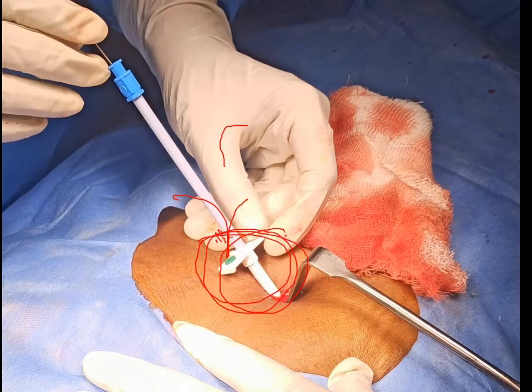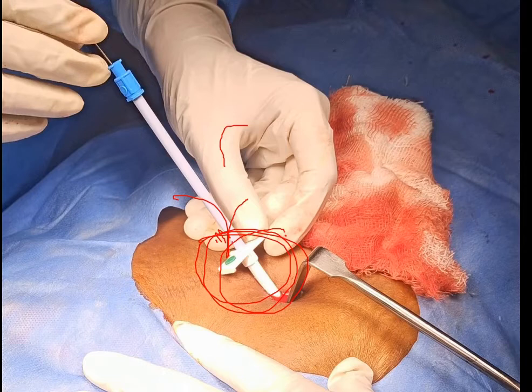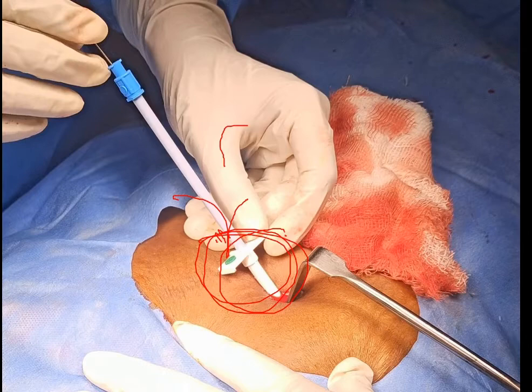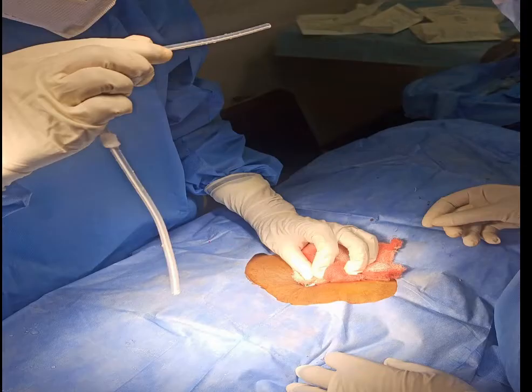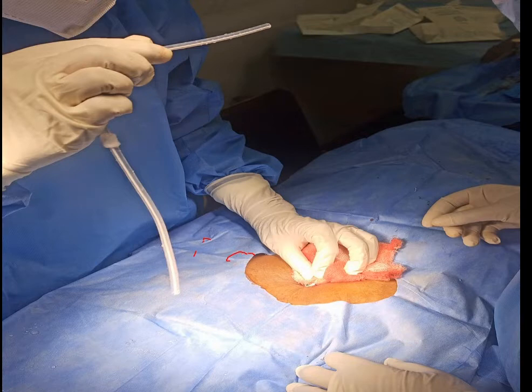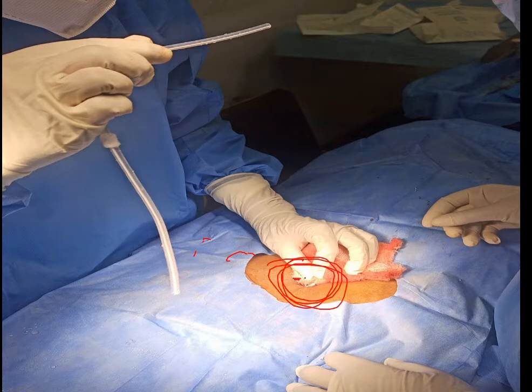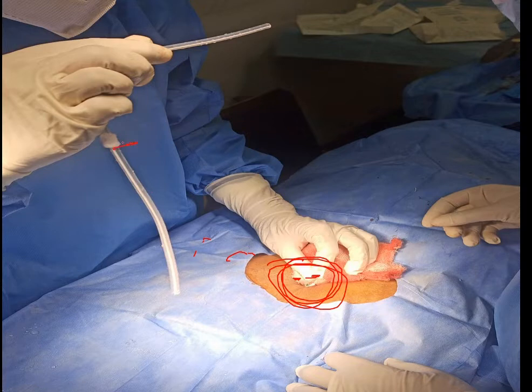Meanwhile we slowly remove the guide wire and the dilator together, similar to the permcath insertion. At this point the patient might experience significant pain. Once we have removed the dilator along with the guide wire, only the peel-off sheath remains — similar to the permcath technique.